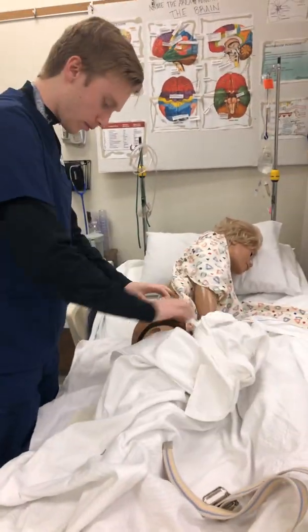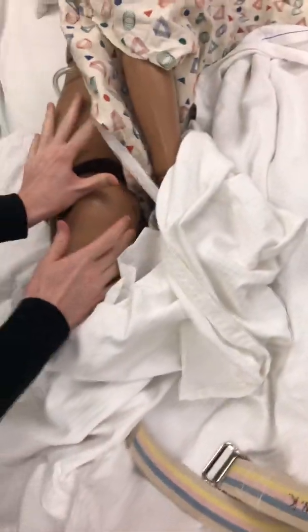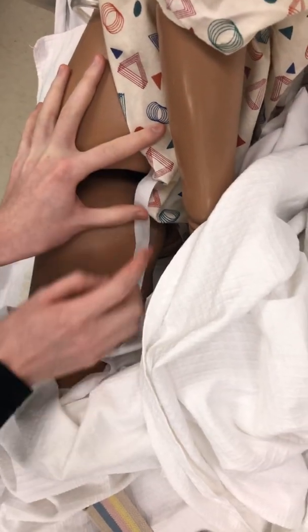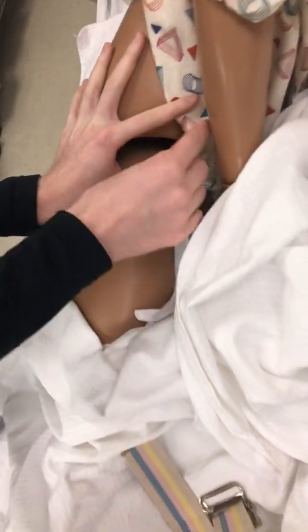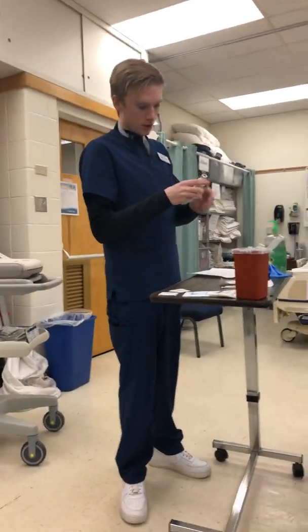You would ask the patient to go on their side, and you would locate the top right here at the top of the hip, and use your opposite hand and feel that little bump, and then have your middle finger midline, and then it would be right there where my finger is, and that's where you administer the medication. And tuck the patient back into bed. And for the diluent, we used 0.9% sodium chloride.